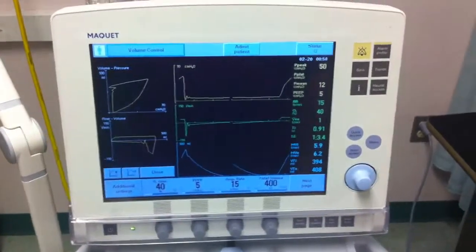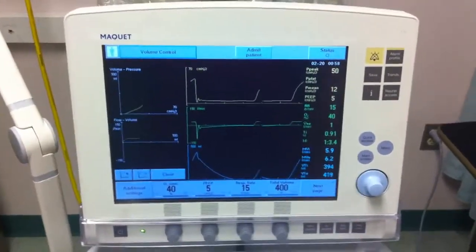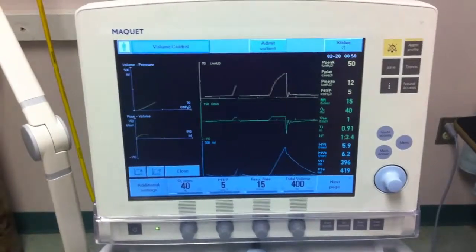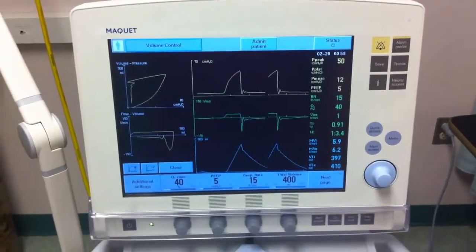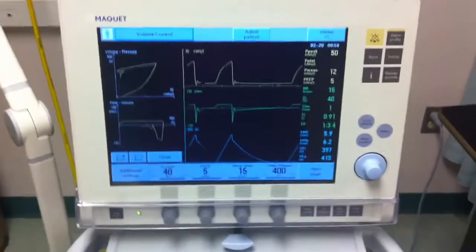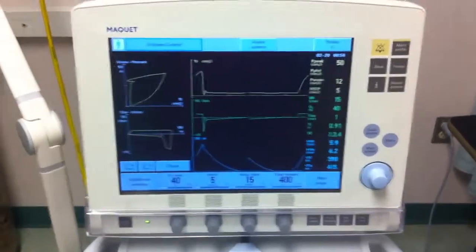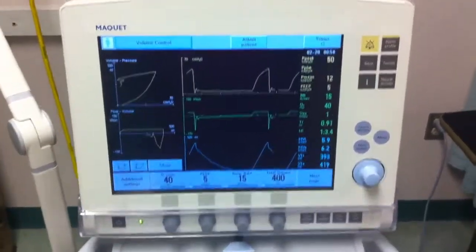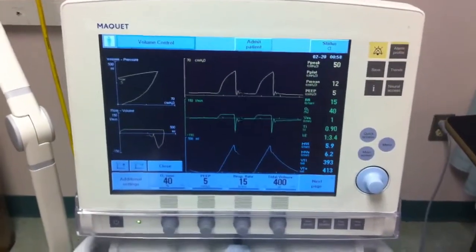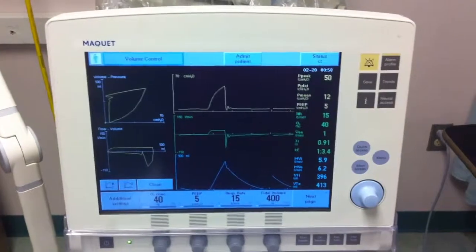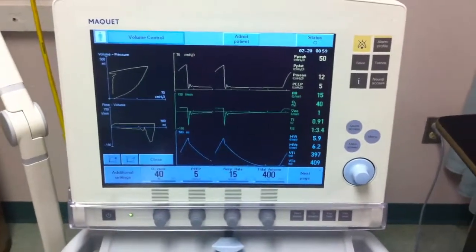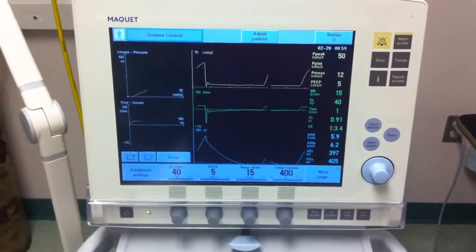This patient is intubated with an 8.0 endotracheal tube. The tidal volume you can assume to be appropriate for ideal body weight at this time. There is no other significant past or present medical history to be noted. You notice an FiO2 of 40%, PEEP of 5, respiratory rate of 15, and assist control. You notice no spontaneous respiratory effort at this time.